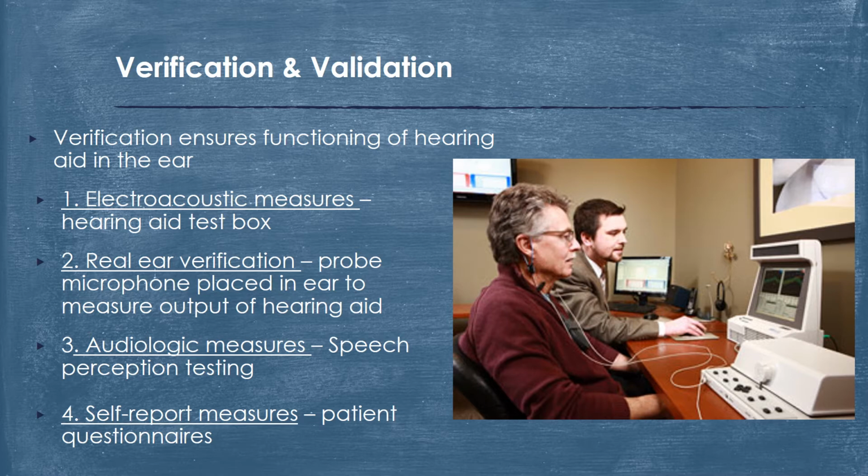That box itself is on the right of the screen here, and you can measure hearing aids in this box without the patient. So you can get your hearing aid set with your prescriptive strategy by just entering their hearing thresholds in this hearing aid test box, and then by setting the hearing aid based on the recommended gain. And so it's actually pretty easy.